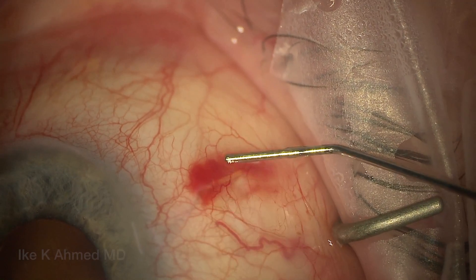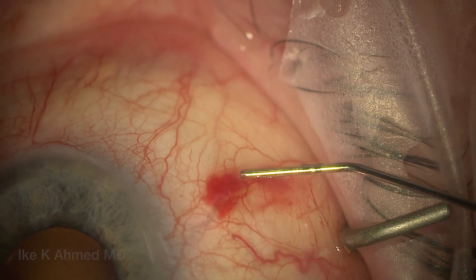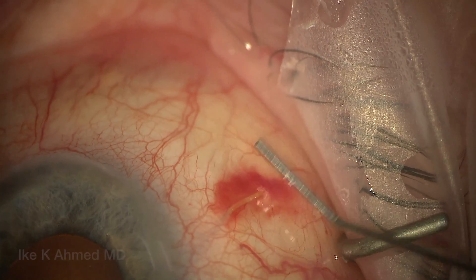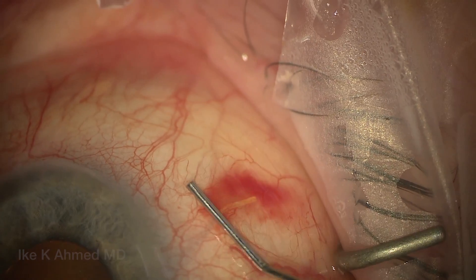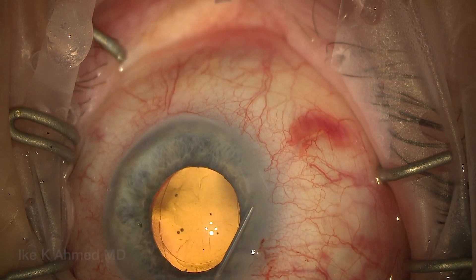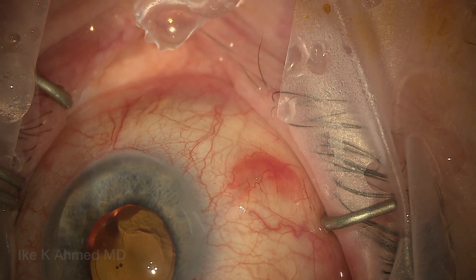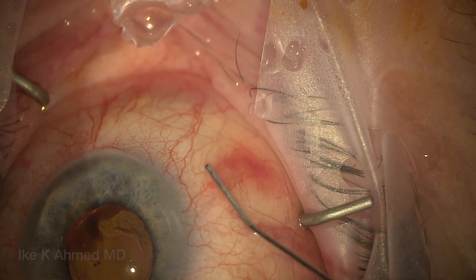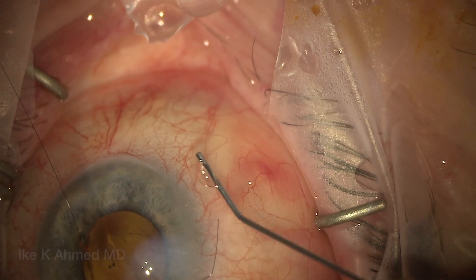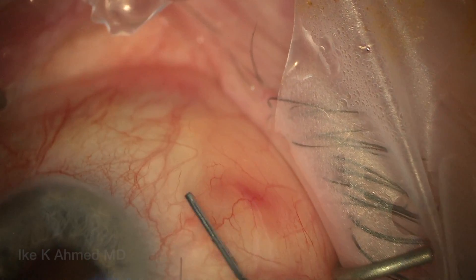You've got about a couple millimeters of the implant in the subconjunctival space. I like to make sure the implant is free and mobile — you can see how free and mobile it is, it's not stuck down, very easily maneuverable by the cannula. We'll milk it a bit to ensure we have a nice placement, and we know this is likely to be superficial because of how free and mobile it is. We'll now inject BSS in the anterior chamber, removing the Helon GV while we do that. Watch the bleb form here — this is priming the implant. You'll see very quickly how wide the bleb forms, which tells us we're quite superficial and the fluid is all going more subconjunctival.